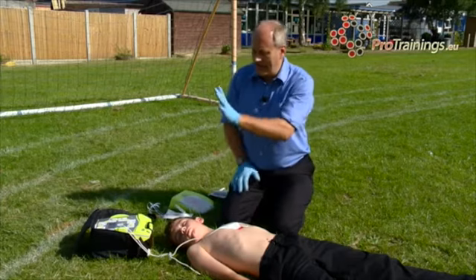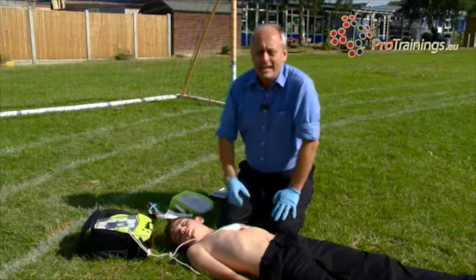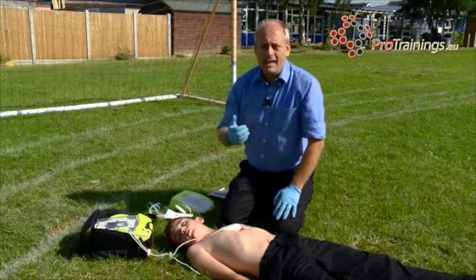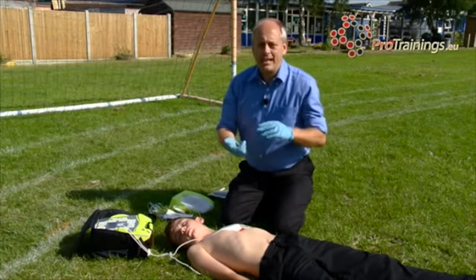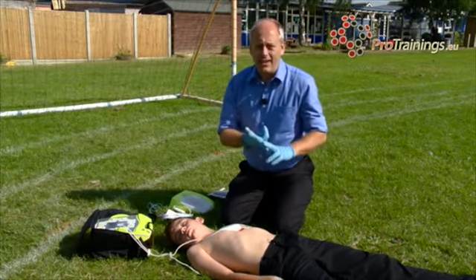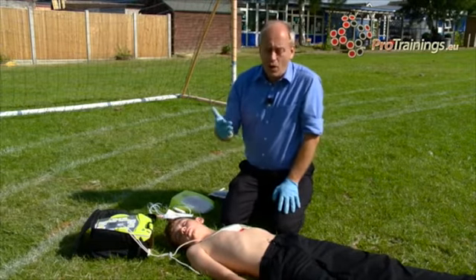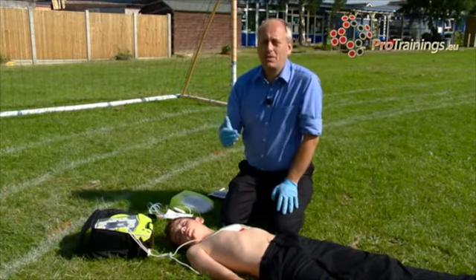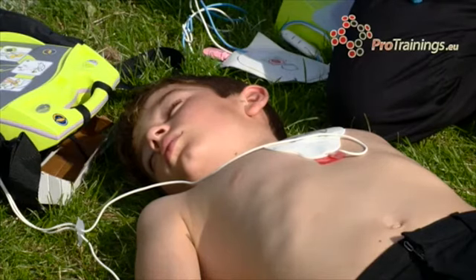So in this scenario here, it's plugged in. What's then going to happen? It's going to go through an analysing phase. It's analysing the heart rhythm to find out whether it's a shockable rhythm. If it's a normal heart rhythm and it's beating, it will say no shock advised. If the heart is flatlined, then it's no shock advised. It's only if it's in VF. Often with children, it will remain as non-shockable because often, as we said earlier, it can be a respiratory problem rather than a cardiac problem.